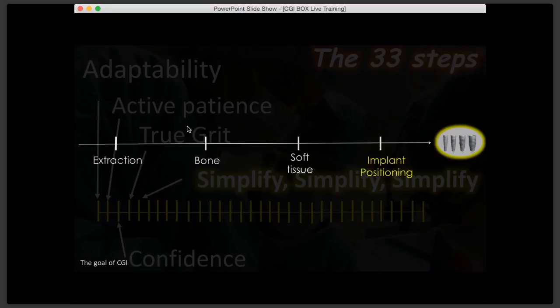Okay, bone loss. Is this a periodontal problem? Well, this patient is not a periodontal patient. What's the possible diagnosis? Dentistry is not that complex with these types of situations. What can it be? Yes, it can be a localized foreign body reaction, peri-implant disease, an enamel pearl, all these rare things. But the more likely explanation is this patient had either a crack or a perforation of the root canal at the time of treatment, and clinically it really tells the story.